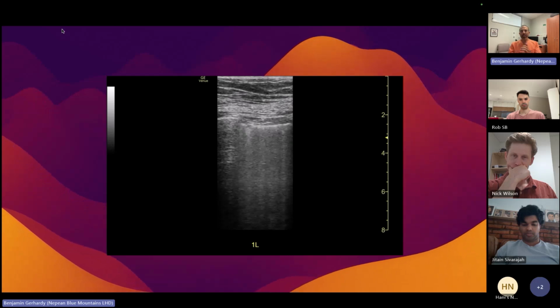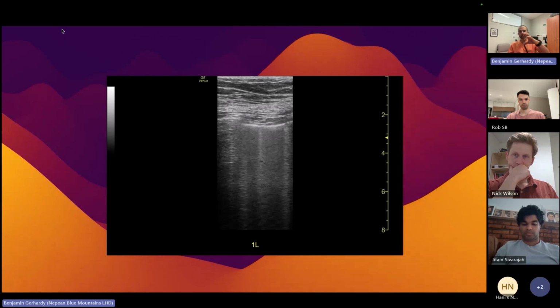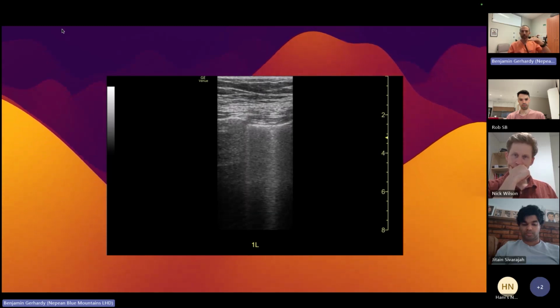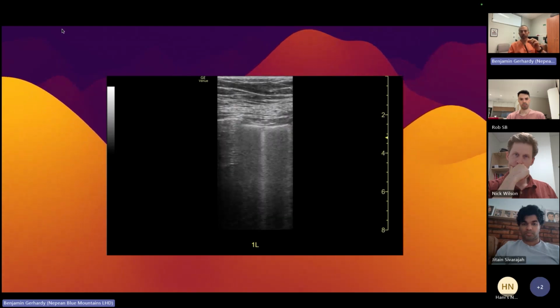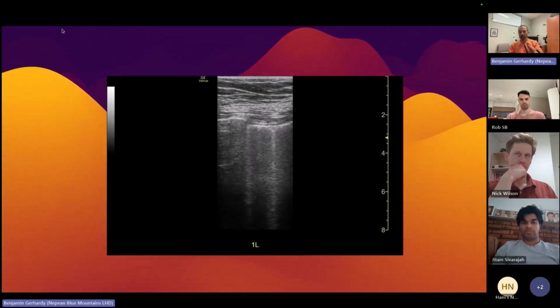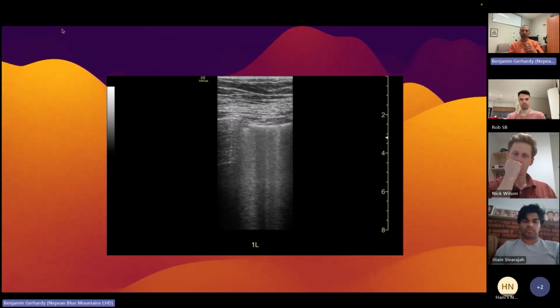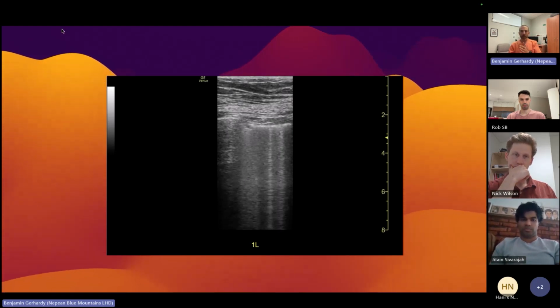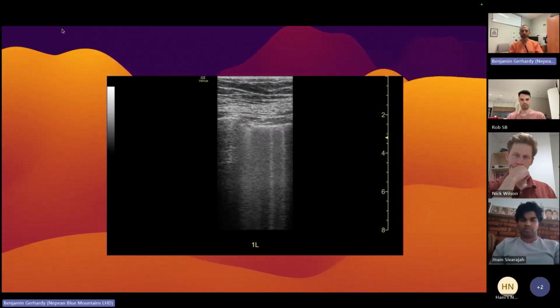And so everything to the left of where that stops, everything up that way, where you can see what looks like a bit of tissue moving in and out, that's nothing. So what is under that pleura, you can't see. You have no idea. It's just space. You don't know whether the pneumothorax is that big, whether it's that big, you have no idea. But you do know that the lung is no longer touching the parietal pleural edge there. So in terms of procedures, if you want to try and get some air out of it, or whatever you're going to do, you have to be in this image to the left of that. But again, you don't know how far down you can go.